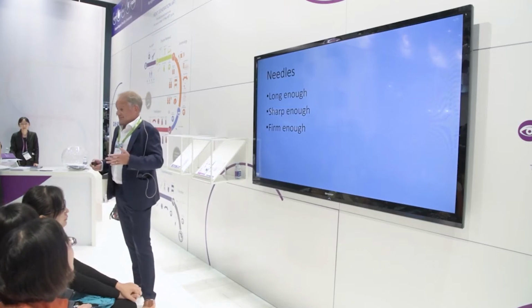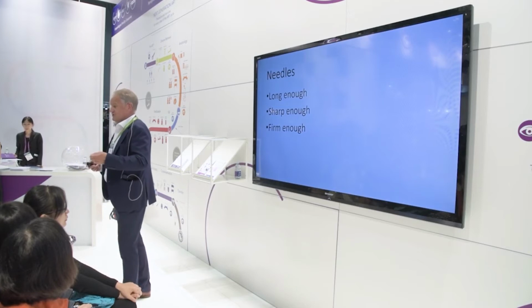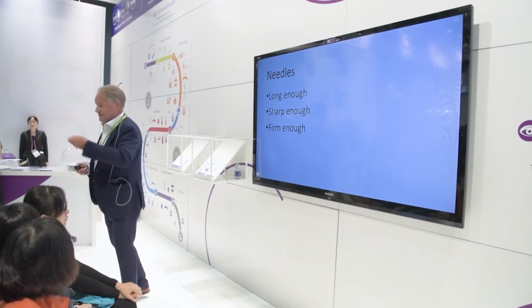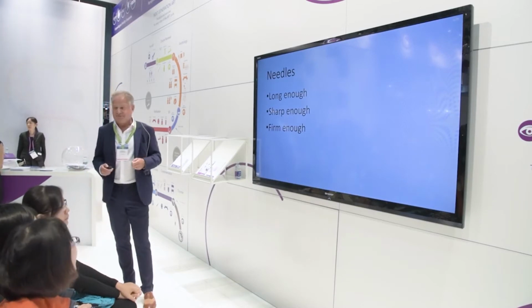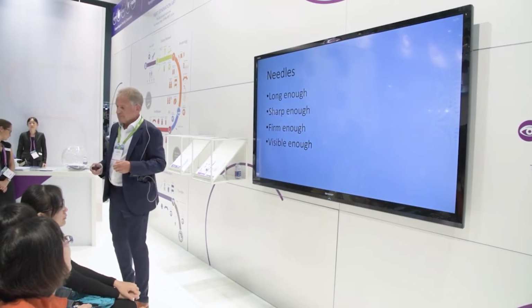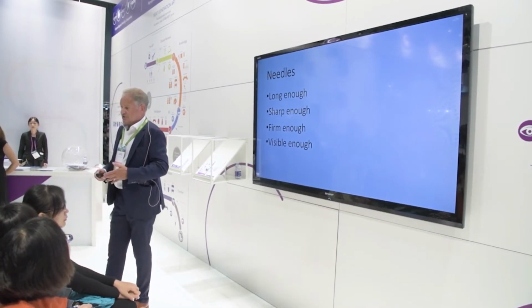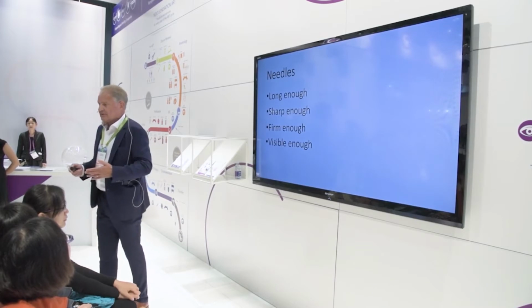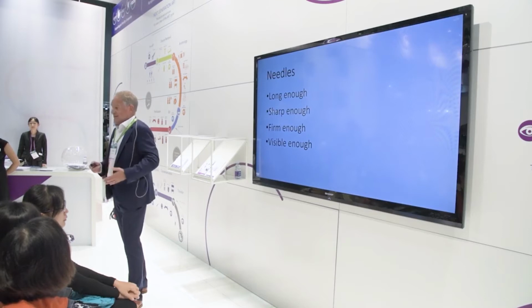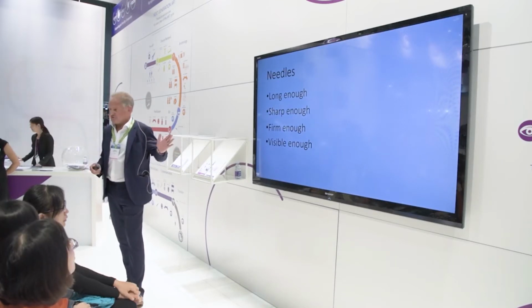And again, many years ago, I'm sure some of the older clinicians in the audience will remember trying to put needles into ovaries and the ovary rotating round as you tried to pierce the capsule of the ovary. Obviously, it has to be highly visible so that you can easily see it on ultrasound, and more importantly, you can easily see it when it disappears, so that you can stop what you're doing and refocus, relocate the needle and start again.